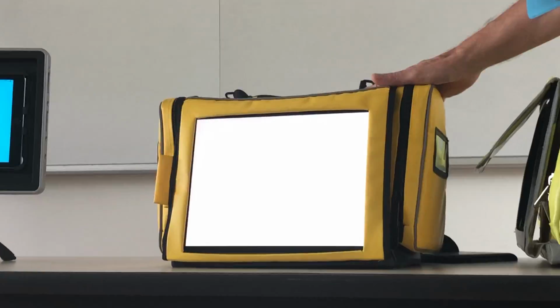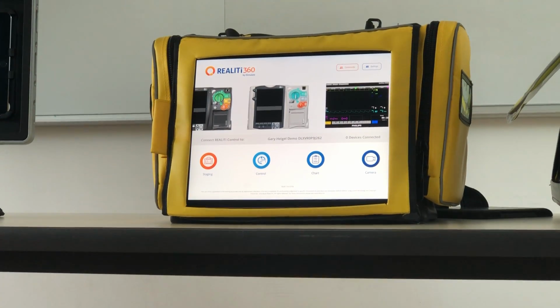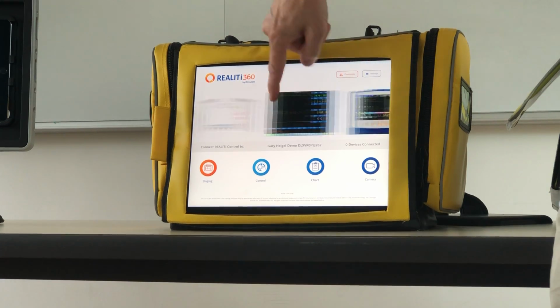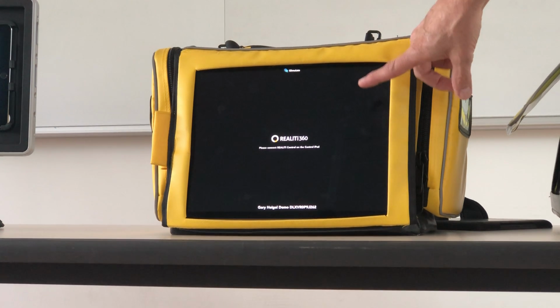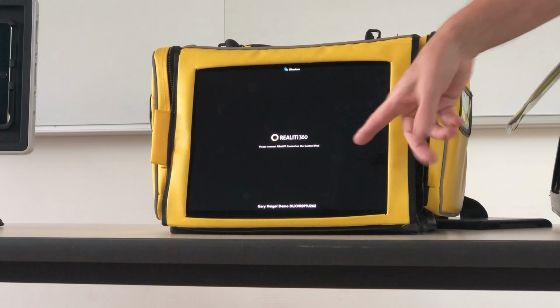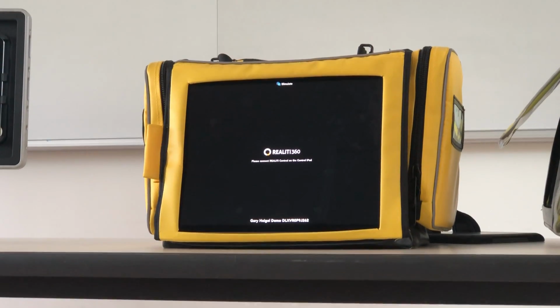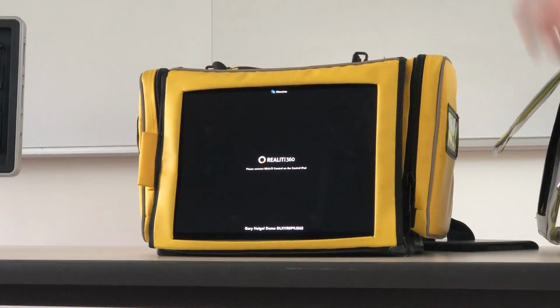So if you start this on the demo pack first, you can set it up to come up in a number of different ways, and I've got this one configured so it comes up here where, if this is your startup, you can start by telling it what monitor you want to pick. What I would recommend is you bring it up in the monitor screen, which is called staging on here, and it just comes up and says connect the control pad. That way, from your control pad, you make all the decisions about what monitor, the student information, anything you're going to do. And once that's turned on, I do the same little orange thing here.